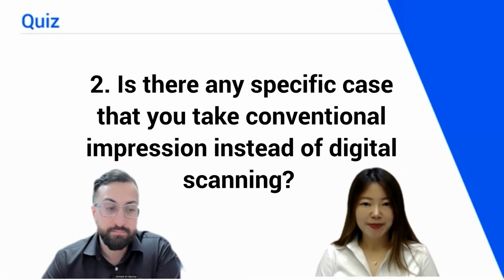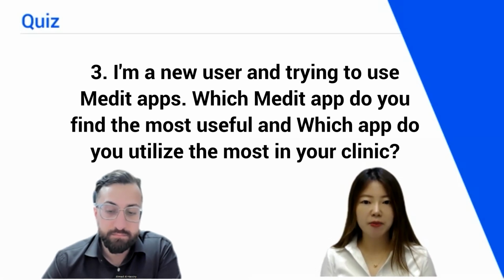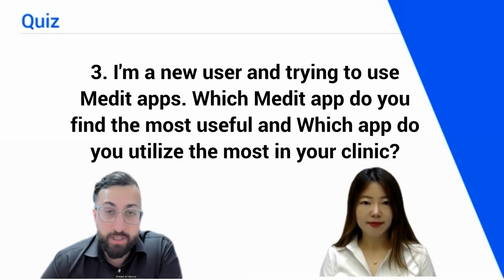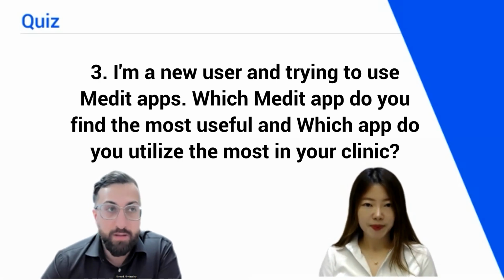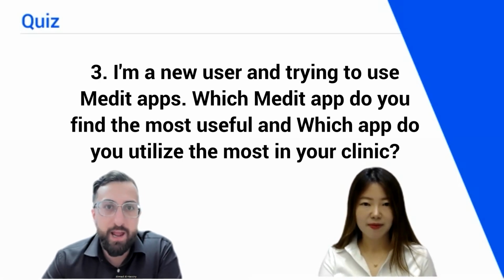Okay, question number 3. I'm a new user and trying to use Medit apps. Which apps do you find the most useful and which app do you utilize the most in your clinic? I would say, to be honest, the most useful is Medit Model Builder by far. I think that is probably one of the best model builders on the entire market. But that's really only useful for you if you're doing something in-house, if you're going to print. If you don't have a printer, Medit Model Builder isn't that useful for you.